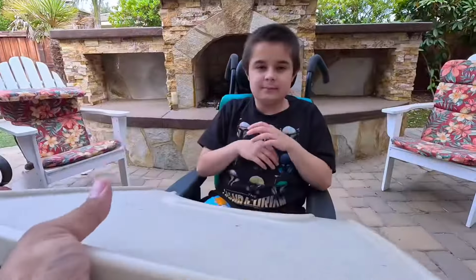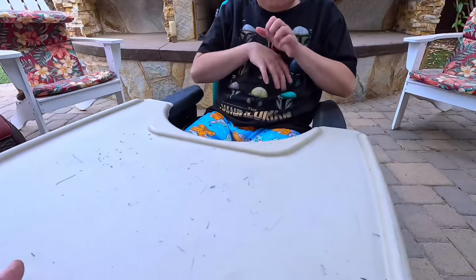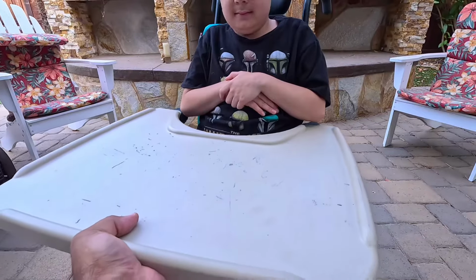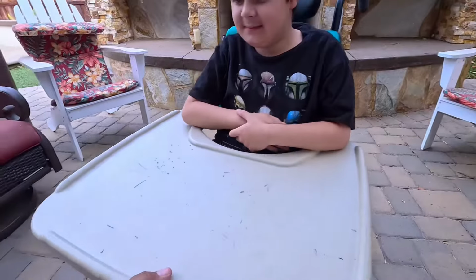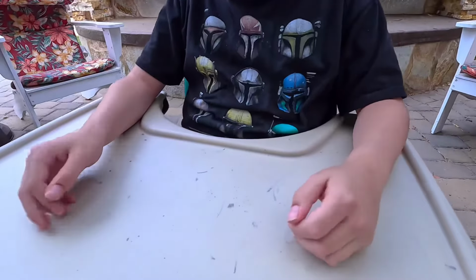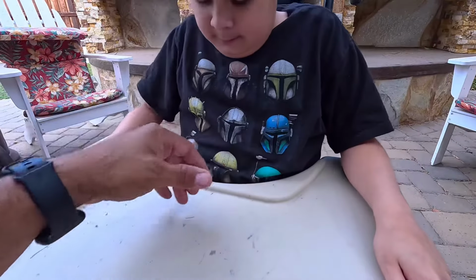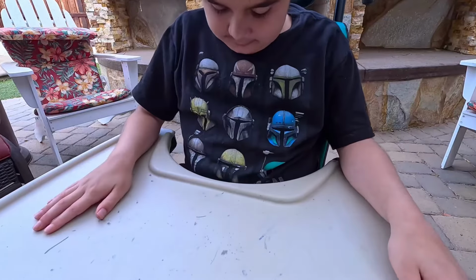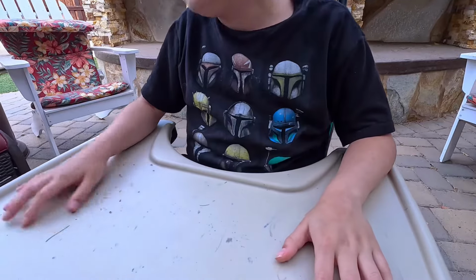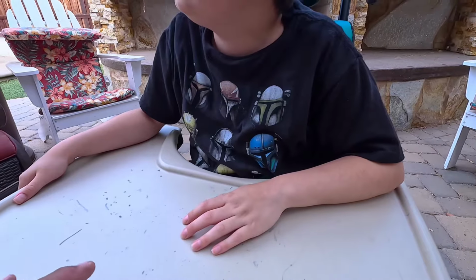So I'm going to line it up to the two armrests, and then while holding the grip at the same time, I'm going to slide it in, and it'll click, so you want to make sure that it clicks. So right there it locked in, and then normally Billy likes to have a little bit of space. He doesn't want to have himself in there. It gives him a chance to adjust his body and shift his weight after sitting long periods of time, which is important for him.